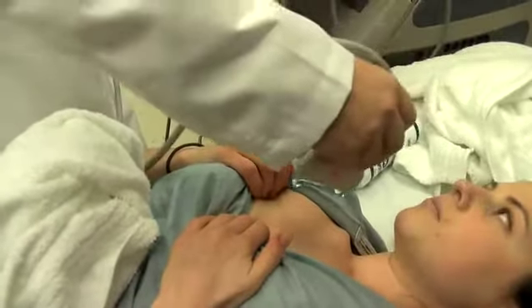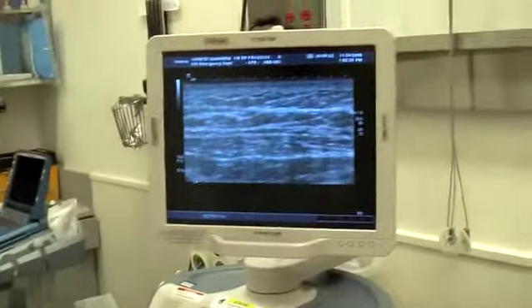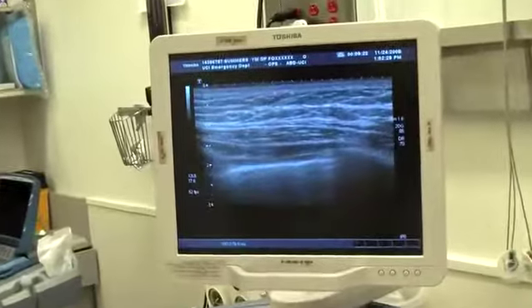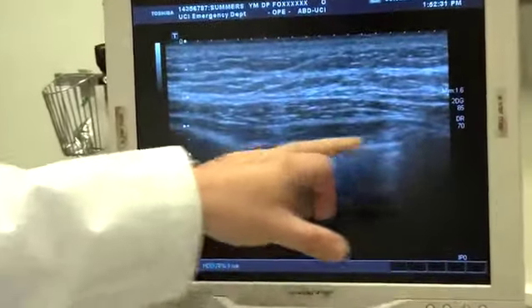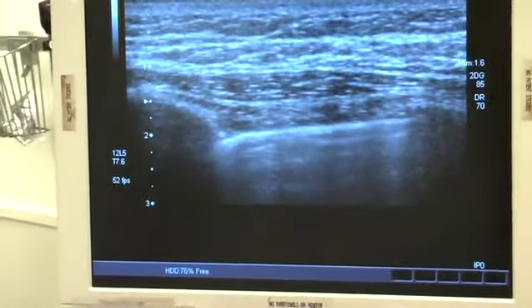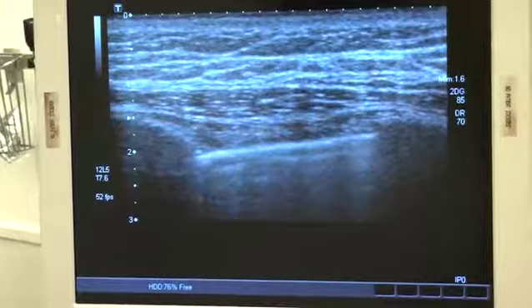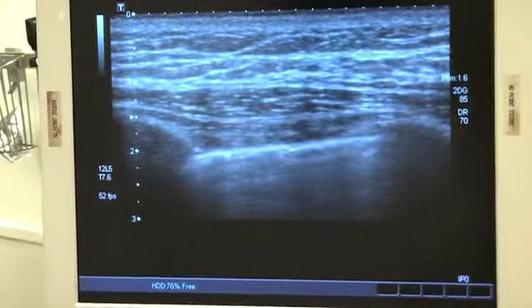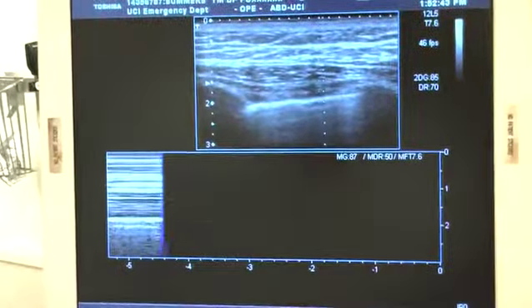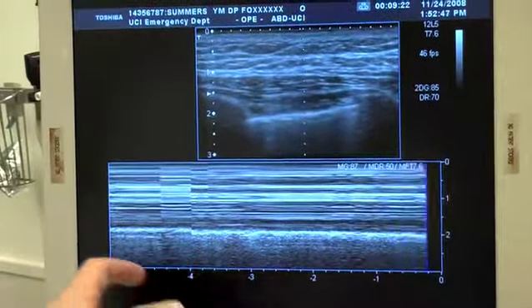A little bit superficial. I'm going to change my depth here. This is the pleural line again. This is the ribs. This is the pleural line in between. So breathe normal. You see the lung sliding. Okay, put the M mode on. Okay, M mode. It's going to bring up my scan line. I'm going to put it right in the middle here. Nice beach. There's motion over time at the parietal pleural interface. So it looks like a nice beach here.